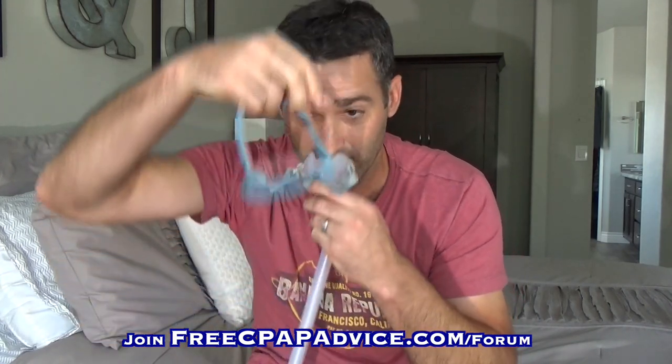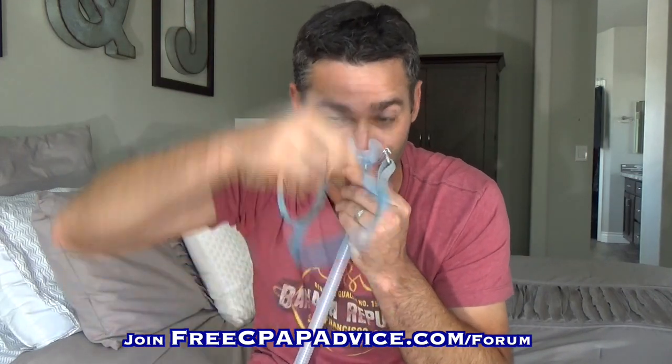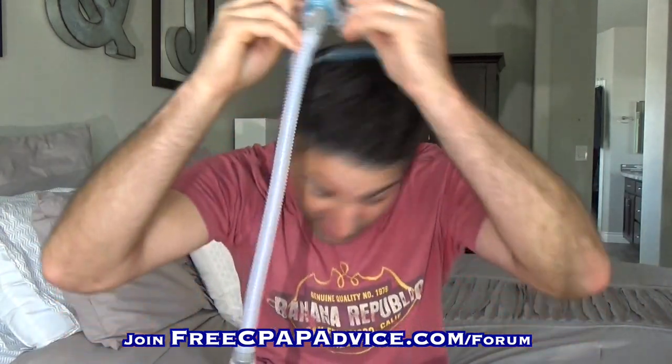Another improvement over the Pilaro is the headgear. The headgear is super easy to get on and off. Just up the nose before you turn it on, then you're going to turn it on and it's going to puff up around it. Pretty easy to get on and off.